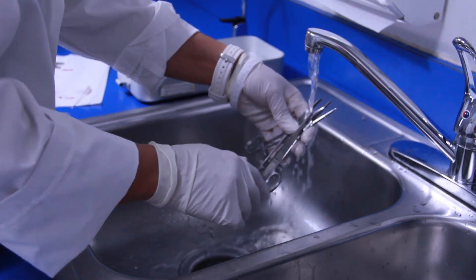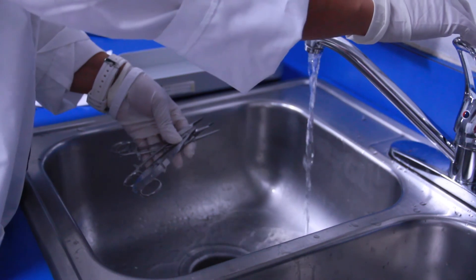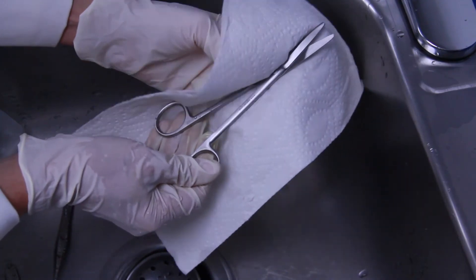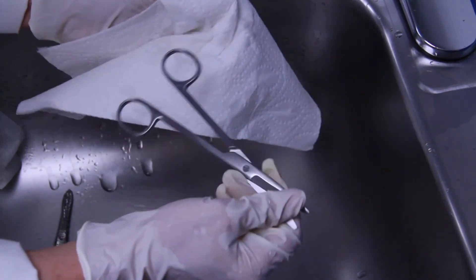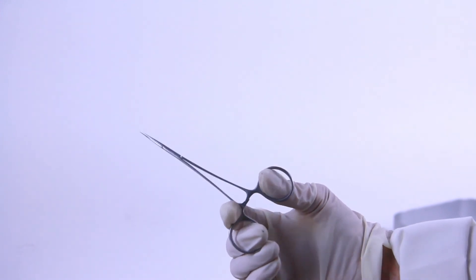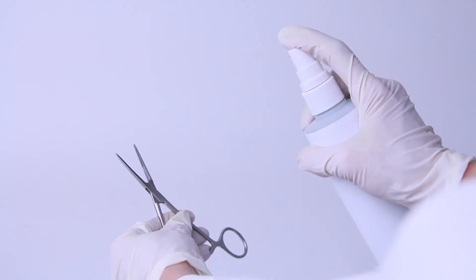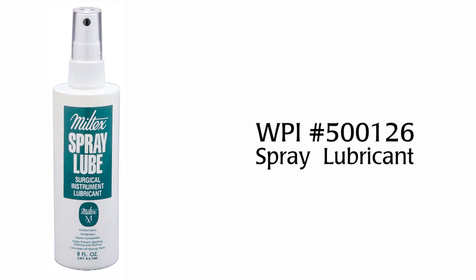Rinse instruments with water to remove ultrasonic cleaning solution and any remaining soil. Dry instruments thoroughly with a clean towel. This minimizes the risk of corrosion and formation of water spots. Visually inspect each instrument. Lubricate instruments after the last rinse cycle and before the sterilization cycle.